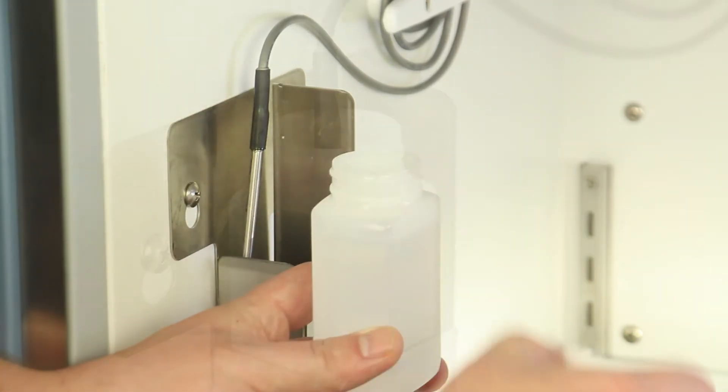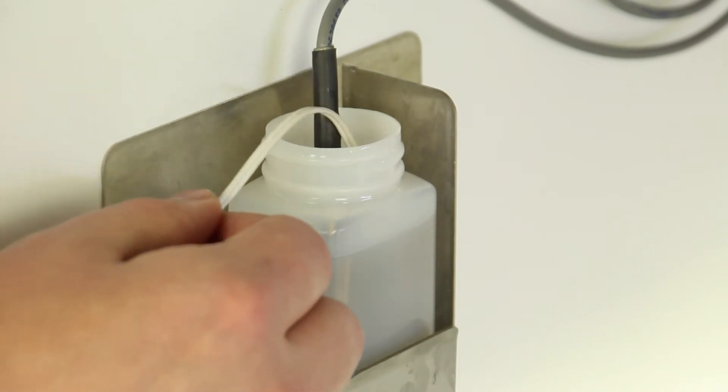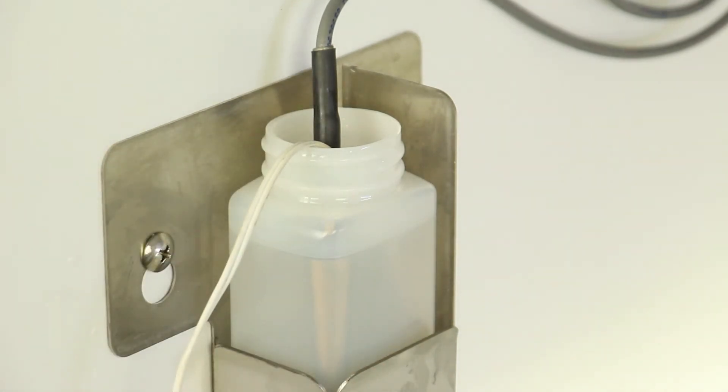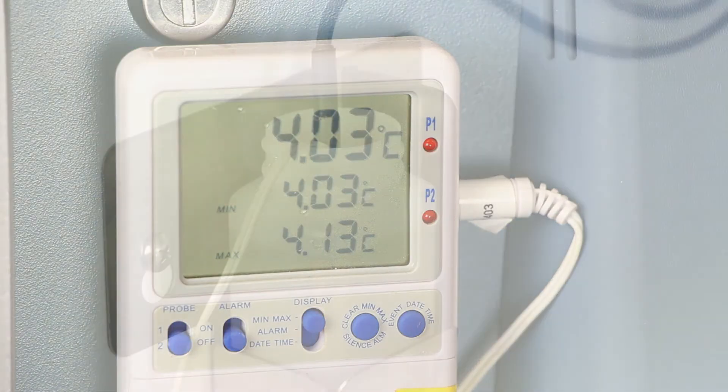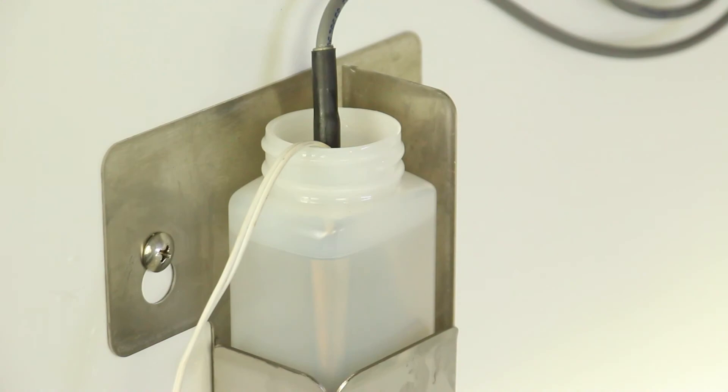Next, attach a calibrated independent reference thermometer, traceable per national standards, to the primary monitor probe and place them in the bottle. The probe and thermometer should be immersed at least 2 inches, or 50 millimeters.